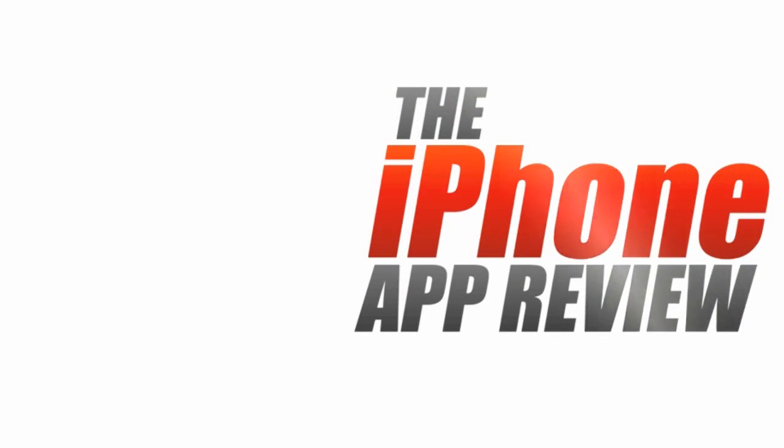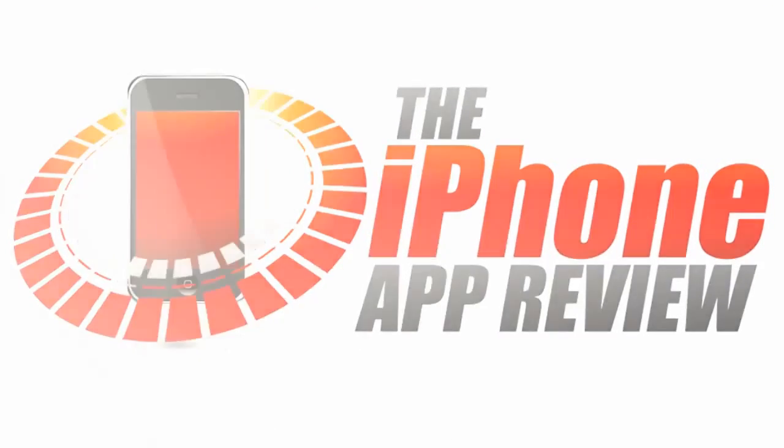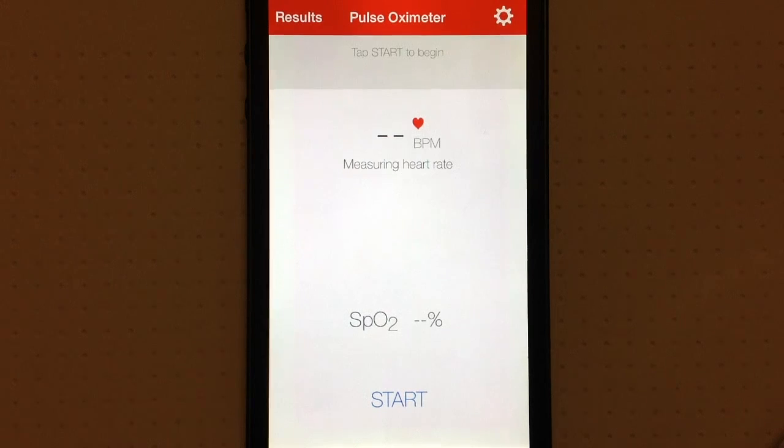This video app review is brought to you by iPhoneAppReview.com. Hey everyone, Sarah Hanlon here with iPhoneAppReview.com, and today we're taking a look at Pulse Oximeter, which is a great app for measuring blood oxygen levels. It's available to download for $3.99 from the App Store, and I'm going to show you how it works.